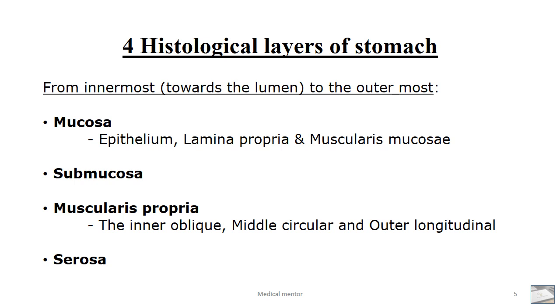The muscularis propria has three layers: the inner oblique, middle circular, and the outer longitudinal layer. The function of the muscularis propria is to control the peristaltic movement.